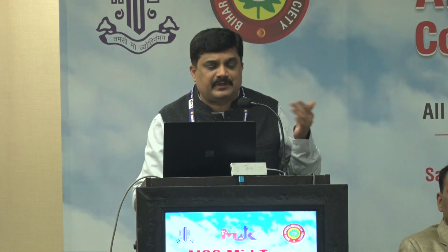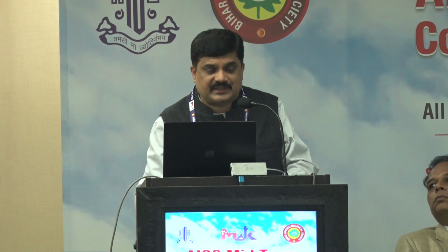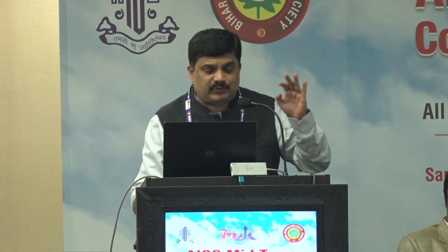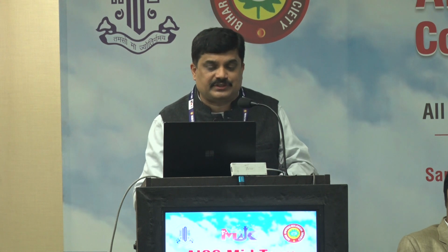So manual keratometry has two principles, basically fixed object and variable image size, and also fixed image and variable object size. Coming to the automated keratometer, most of us are using this. The principle is it focuses the reflected corneal image from the central 3 mm zone onto an electronic photosensitive device which instantly records the size and computes the central 3 mm zone radius of curvature.